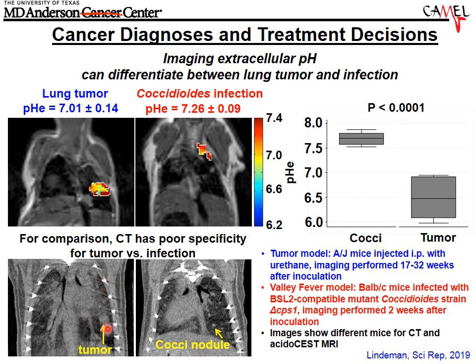For comparison, CT cannot differentiate between a tumor and an infectious disease nodule. That is becoming important as we see residual disease from COVID-19. However, we have not fully implemented this method for lung imaging in our clinic yet. And if we could, then the uncertainty in CT could be alleviated by doing this molecular imaging method.